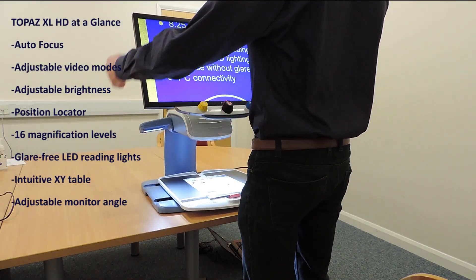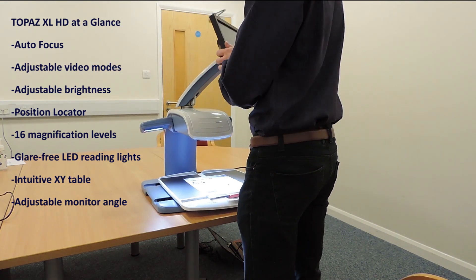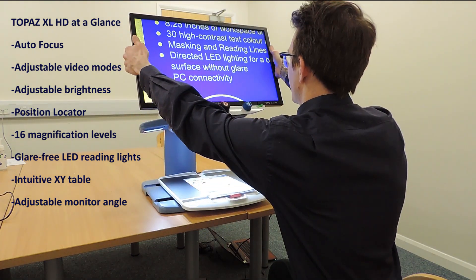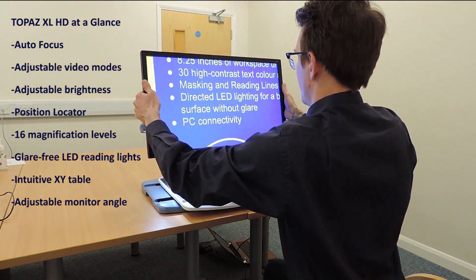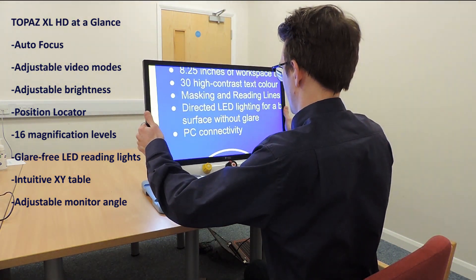With simple to use controls you can make quick magnification, colour and brightness adjustments to best suit your vision needs. The HD camera produces a clear picture with sharp images and crisp text.